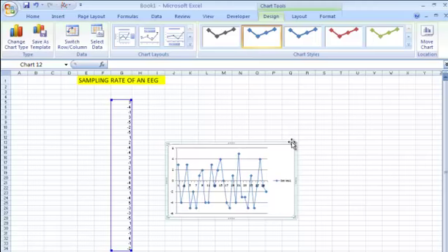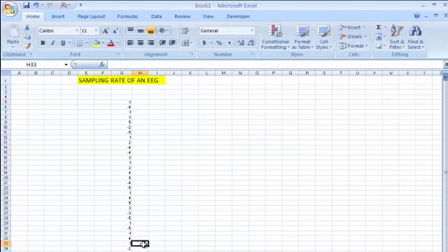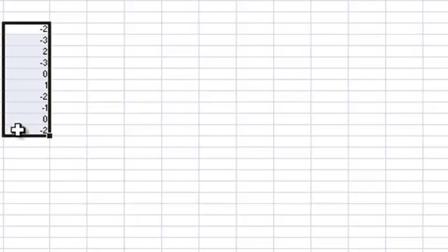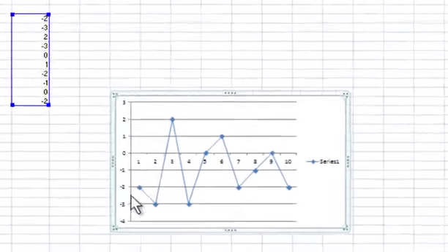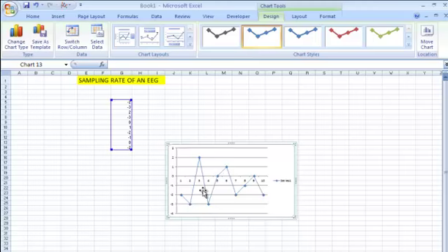Okay, what happens if I don't do that? Let me cancel this here, and I just take a sampling rate of 3, 4, 5, 6, 7, 8, 9, 10. If I take a sampling rate of 10 and try to resolve alpha frequency, I get only 3 waves. So this is a delta frequency. So you get a distorted view of the waveforms.